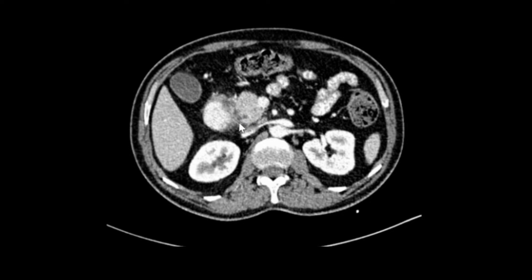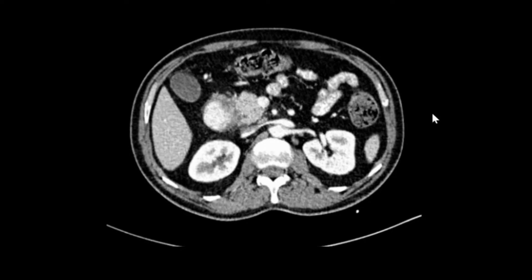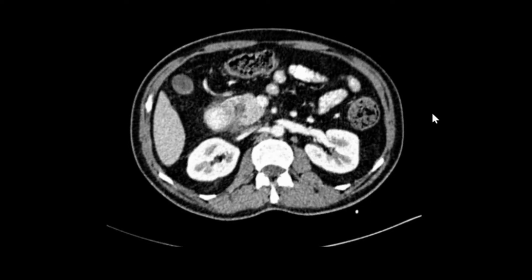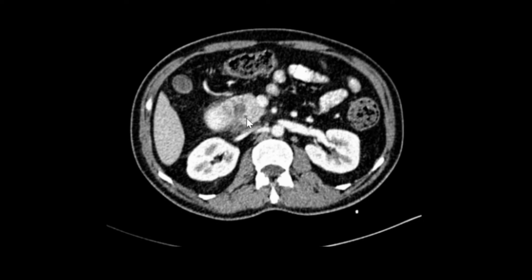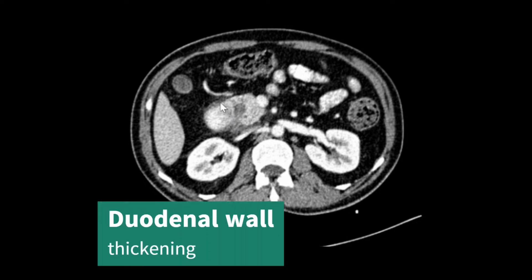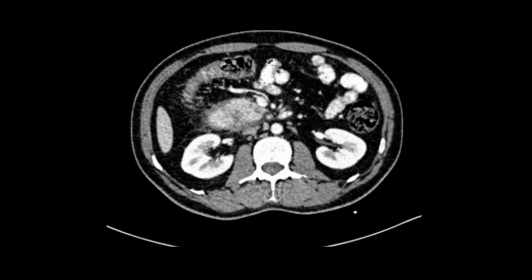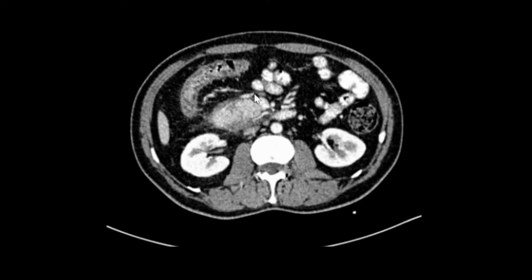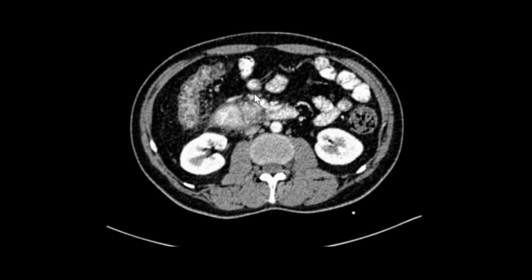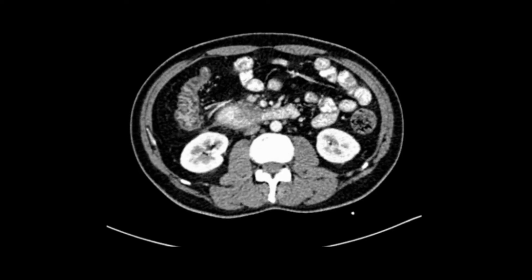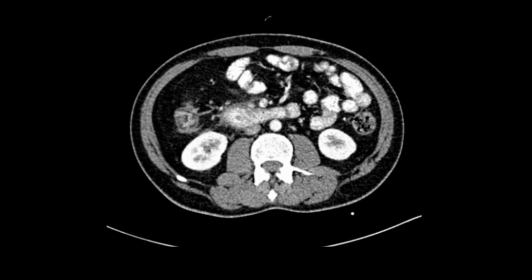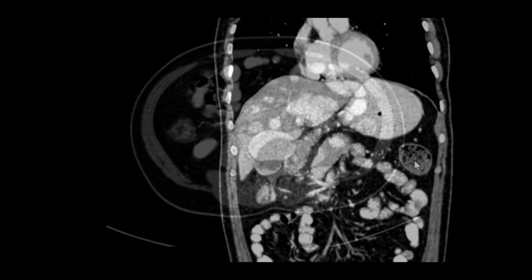As we move down, we can see some cystic changes which are present in the pancreaticoduodenal groove and a little in the head of the pancreas. There is associated wall thickening involving the medial wall of the duodenum. There can be cystic changes in the duodenal wall also. As we move down we can see surrounding mesenteric fat stranding and heterogeneity around the pancreaticoduodenal groove and even the mesentery lower down.